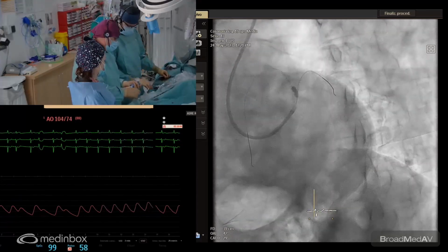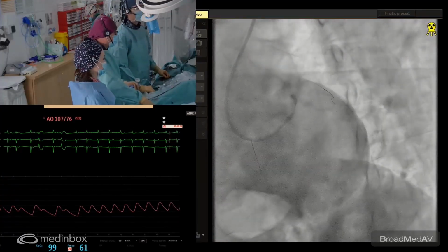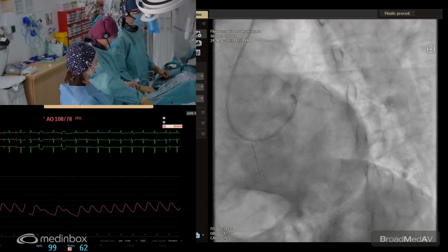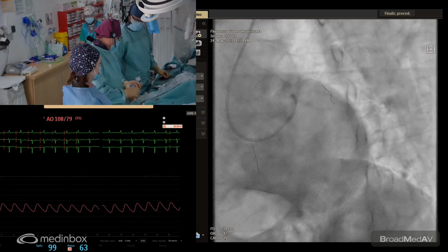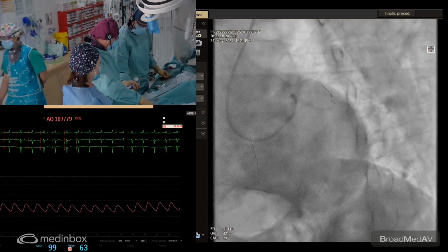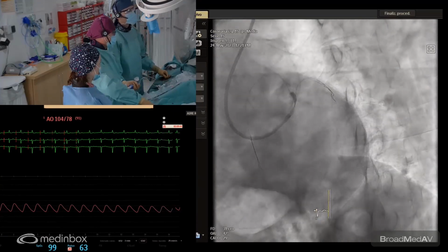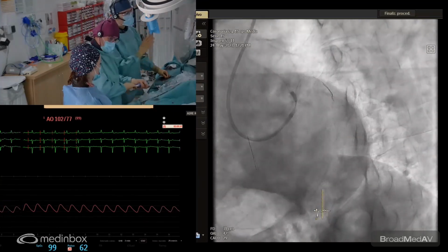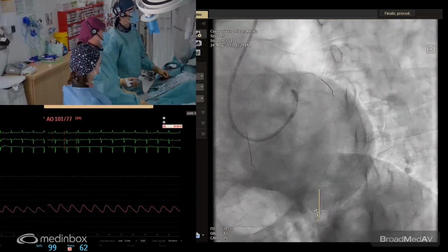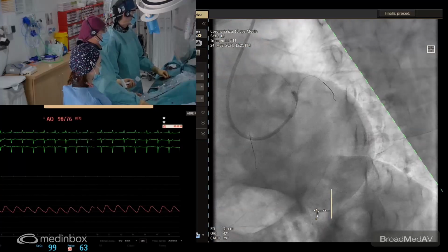And then Guillermo was saying to administer as well at the distal lesion. 4. 4. 6. You can see the bulky calcium outside the vessel, but the expansion of the balloon is quite good.